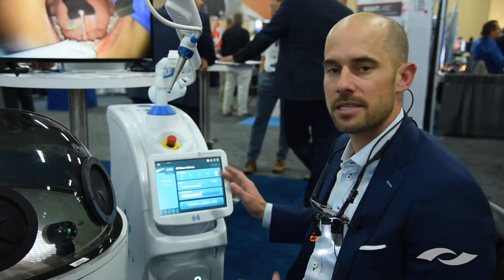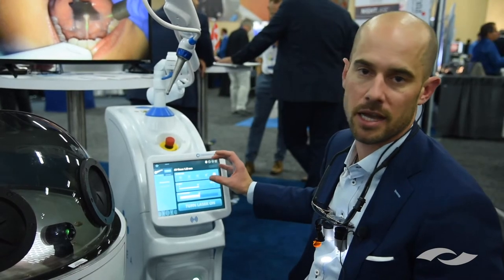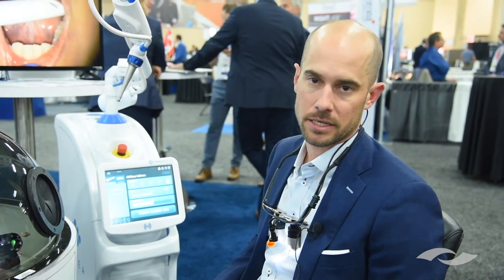Based on how much pressure you put on the rheostat and what spot size you pick, you can manipulate and remove specifically different tissues — whether that's enamel, dentin, cementum, caries, or bone. All the soft tissues and hard tissues that we want to manipulate as general dentists.